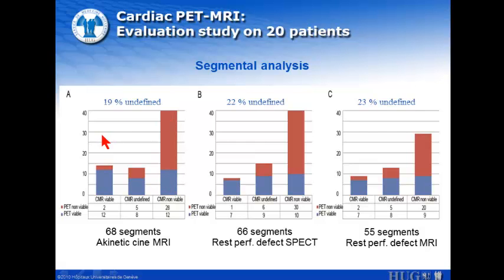Using the two methods we could significantly decrease the number of undefined segments. However, there was a significant number of undefined in MR in PET non-viable regions.